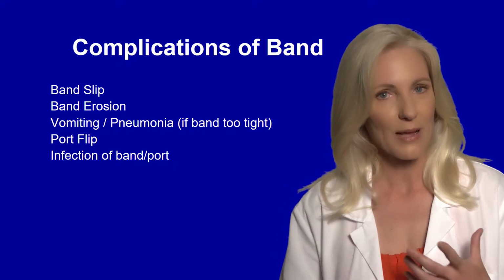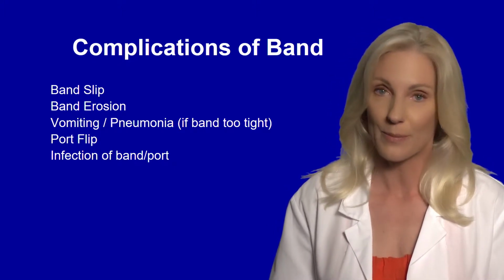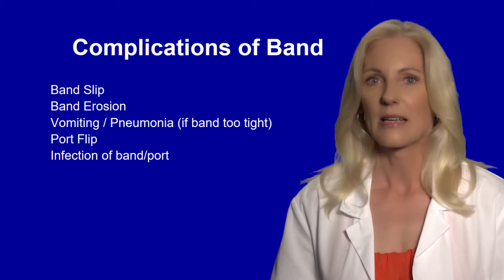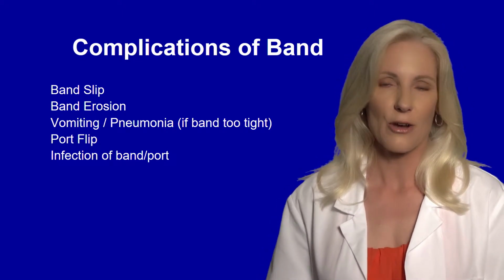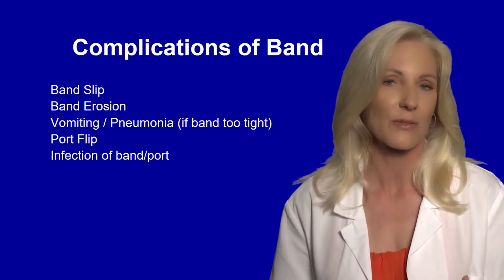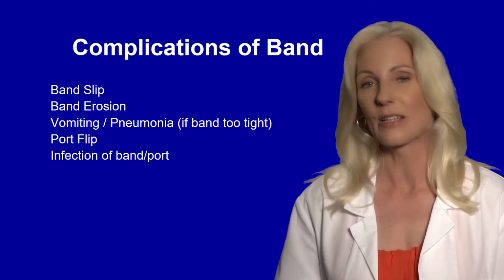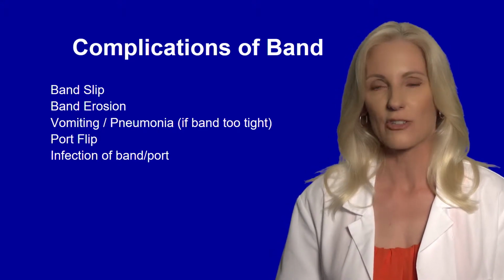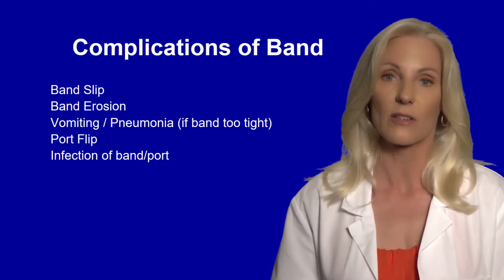I do counsel my patients to eat properly so they decrease their chance of pushing their band out of place. If the band is over-tightened, it can cause what's called an erosion. If a patient goes to a physician who really isn't a bariatric surgeon or isn't really adept at adjusting patients' bands, they might accidentally put too much saline in there and make the band too tight, and it will actually start to rub and chafe and cut through the top part of the stomach, and that's what's called an erosion.